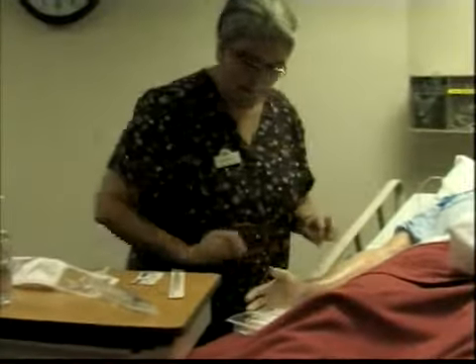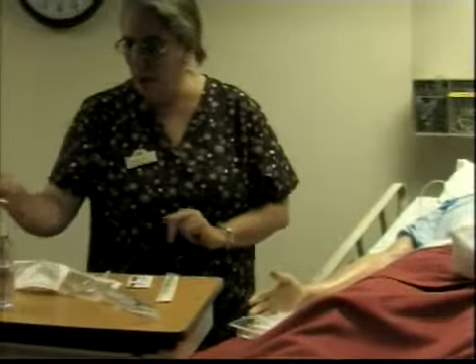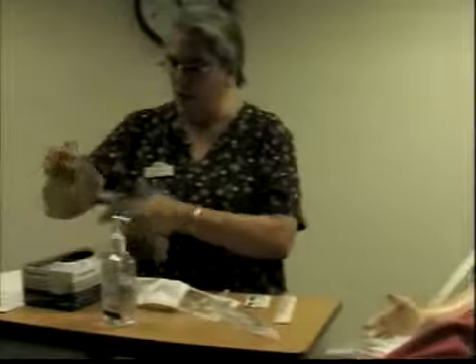Okay, there we go. And we have the tourniquet. Okay, so I'm just going to go ahead and put my gloves on.